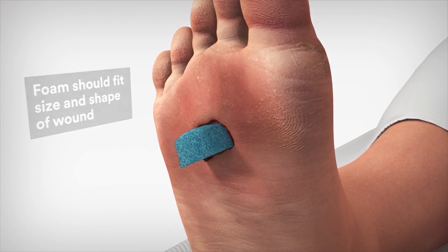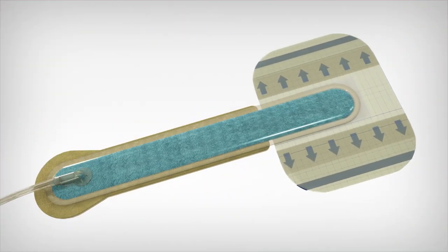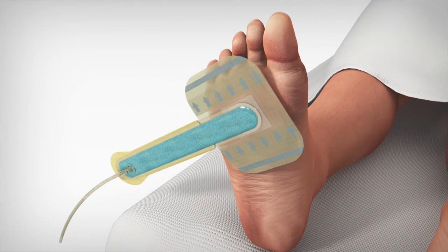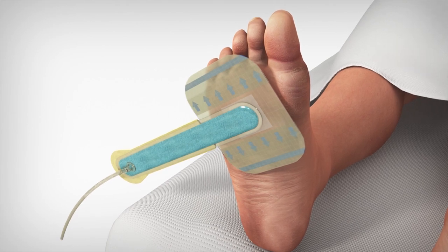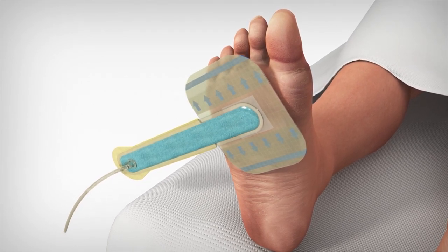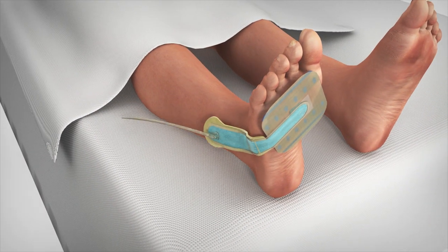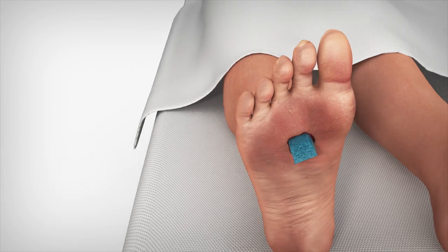Since this wound is on the plantar surface of the foot, it can be beneficial to use the SNAP bridge dressing, which positions the port and the tubing away from the wound to minimize the chance of additional pressure points. The best orientation of the dressing is determined so that the bridge portion of the dressing will lie flat on the extremity and the port is located on a non-weight-bearing surface.